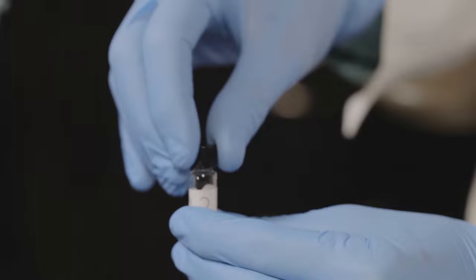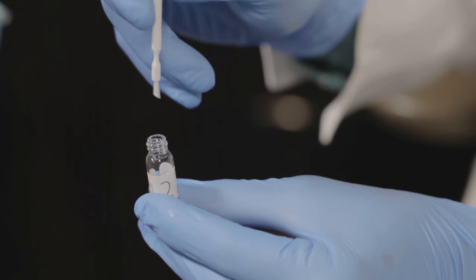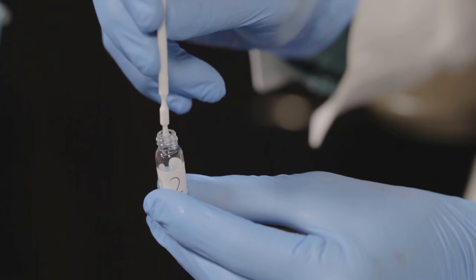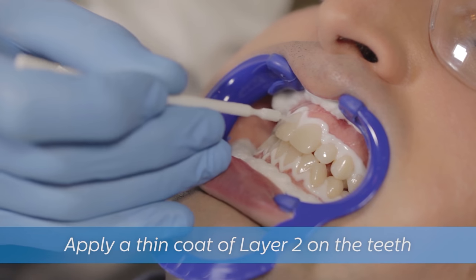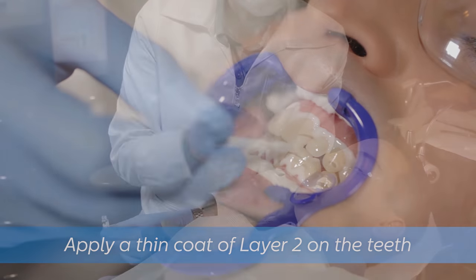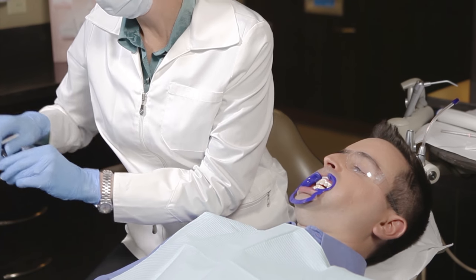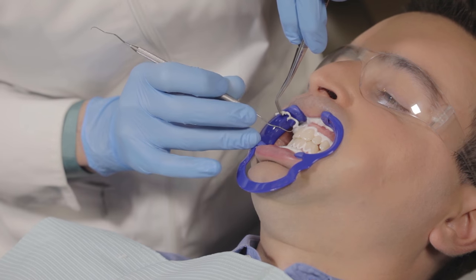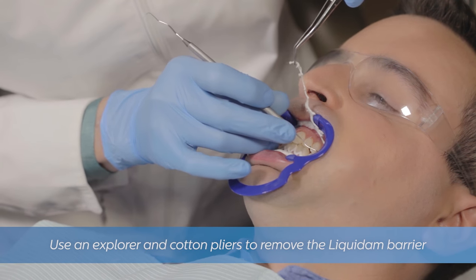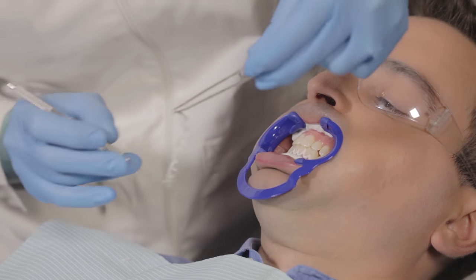Next, it's time to apply the sealer layer. This technology seals the hydrogen peroxide so you can send the patient on their way immediately after application. Open the glass vial of the innovative sealer labeled 2. Using the second of the two provided application brushes, apply using the same technique as the first layer, once again avoiding the soft tissue. Let the teeth air dry for 30 seconds. When the teeth are dry to the touch, carefully remove the Liquidam barrier — for best results, use an explorer and cotton pliers. If adding a fluoride varnish, it can be applied to non-treated tooth surfaces after removing the Liquidam barrier.